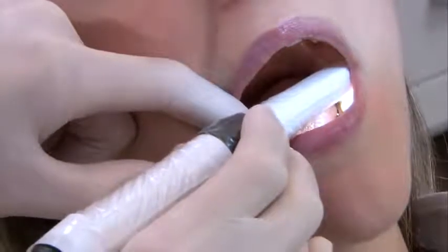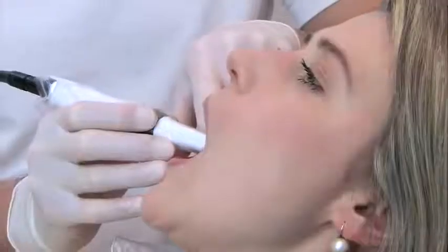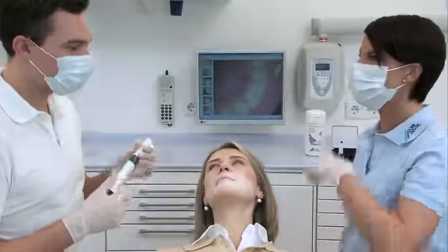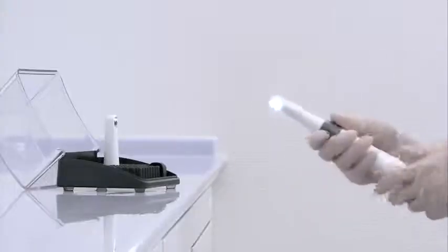Great quality images without blurring can be produced, and video clips can be recorded with superior image quality. The sensitive control function registers that the manual trigger has been activated by causing the camera handpiece to vibrate slightly. Even video clips can be recorded in combination with DBS WIN.